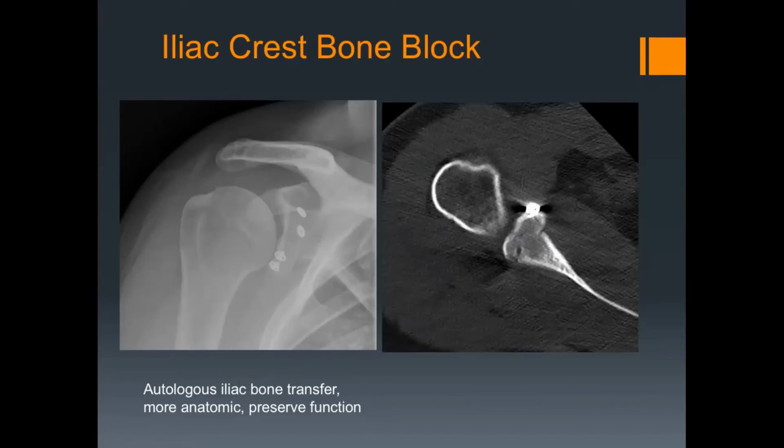My biggest reasons for doing it are you don't appear to get the same lysis around screws and the same problems with screws. If you have a problem here, these are little endo buttons. The ones with the multiple dots in them are at the front, and the others are sitting at the back of the socket, connected by sutures, very strong sutures. So it seems to heal well.